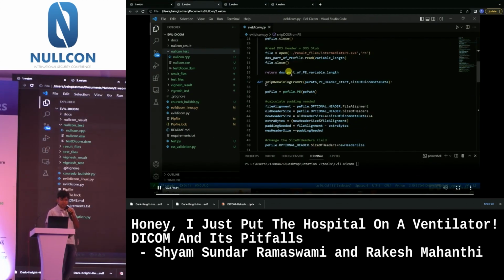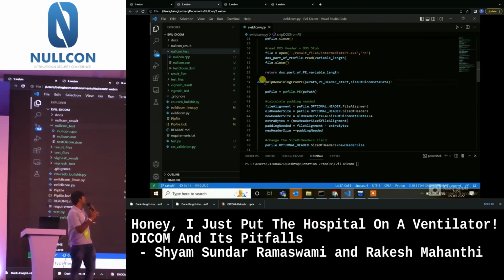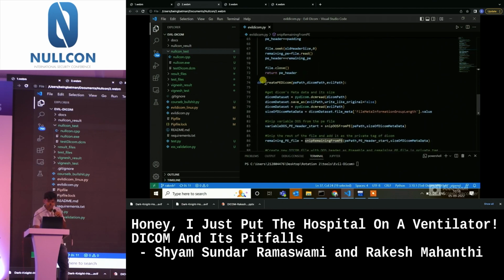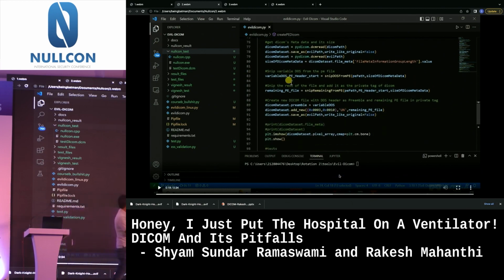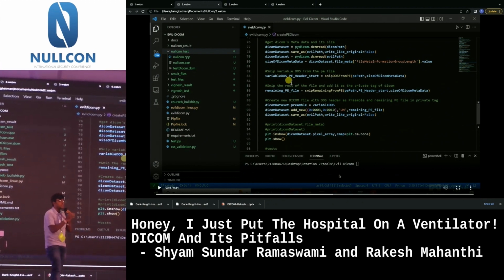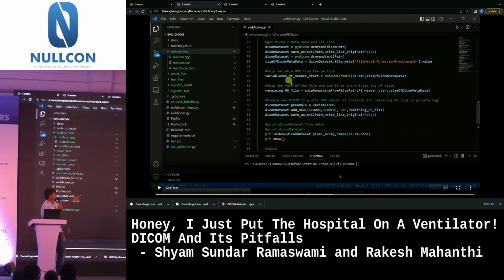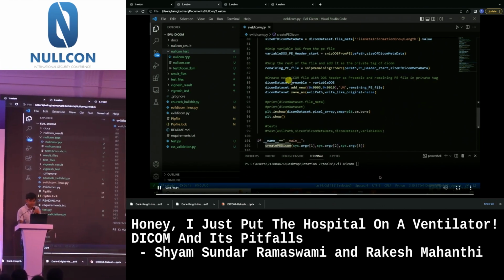I'll just quickly take you through. So it is completely modularized. It's not as easy as you see it, because I have to work at a byte level to create everything. So I chose the tag (0003,0010) to put certain sections of the exe into the DICOM file. I'll tell you the logic, don't worry. Let's first experience the magic and then we'll go through the logic. So I put a certain portion of the portable exe into the 0003,0010 tag, okay?